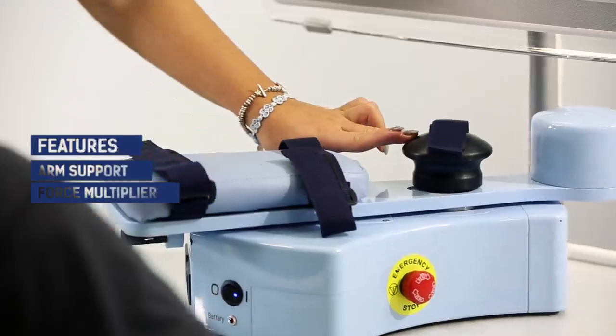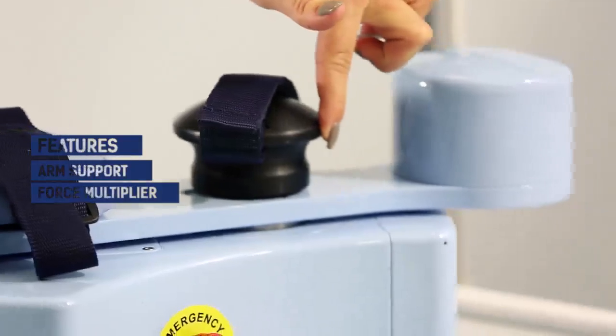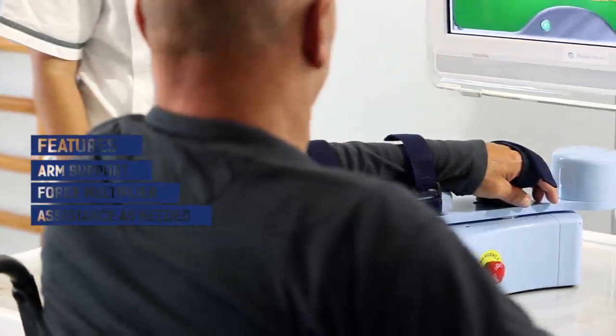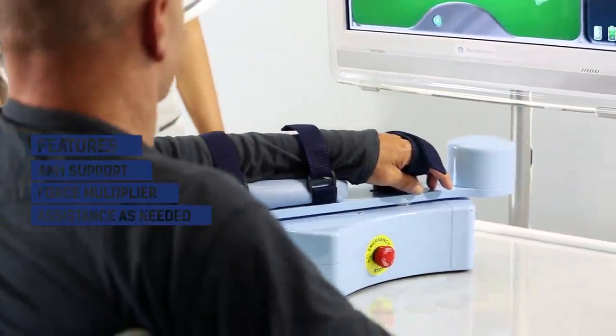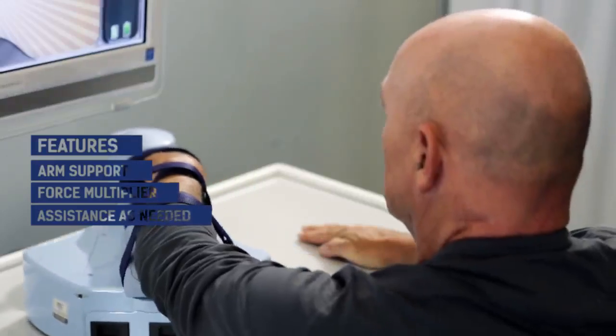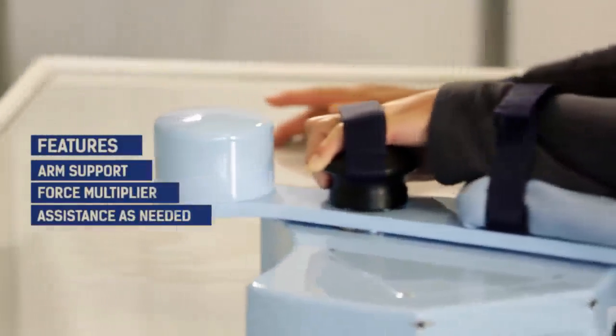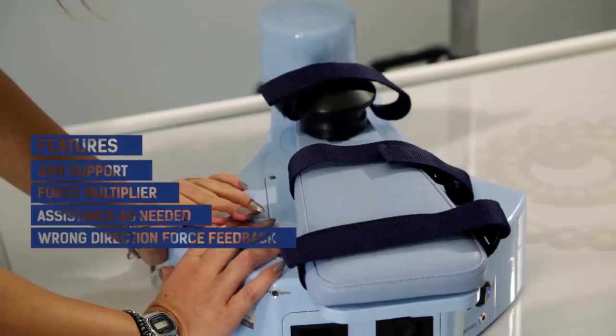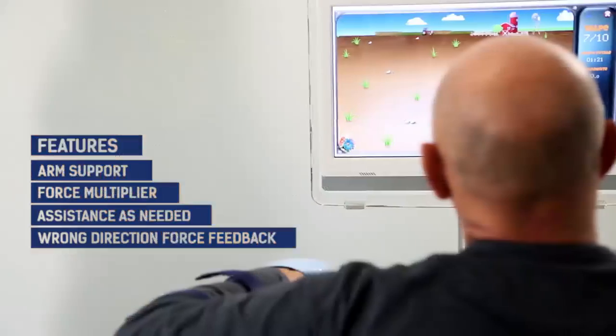Furthermore, the patient is not required to exert the entire amount of force needed to move. In fact, the robot can act as a sort of force multiplier. It measures the force of the patient and answers by applying the right reaction. If necessary, it can give a little push to the patient, or it can oppose their movement if they are going in the wrong direction.